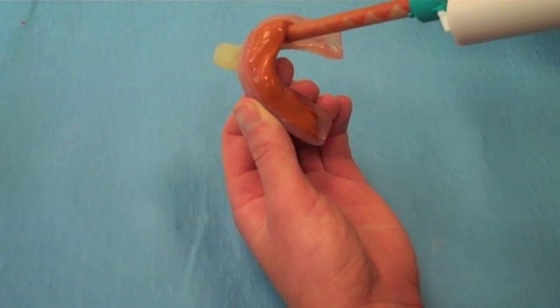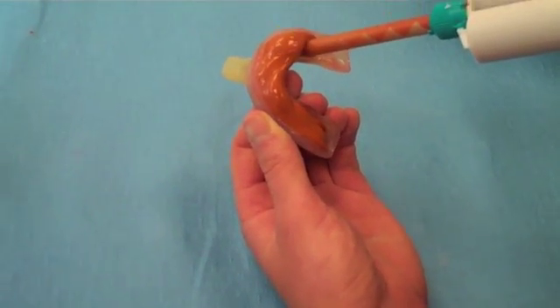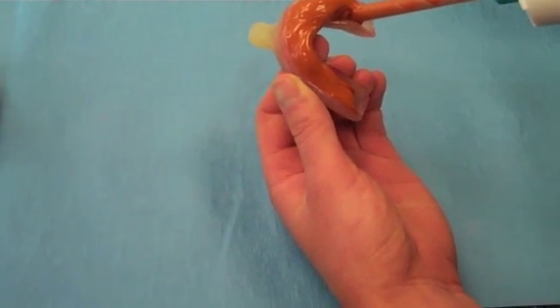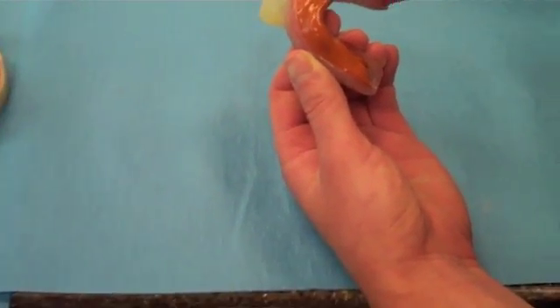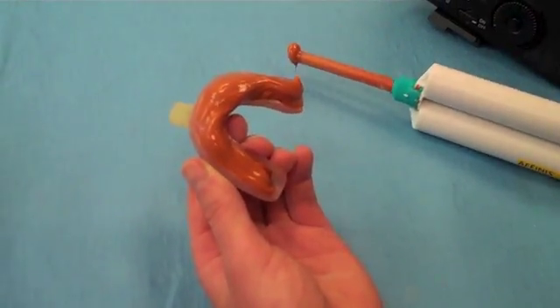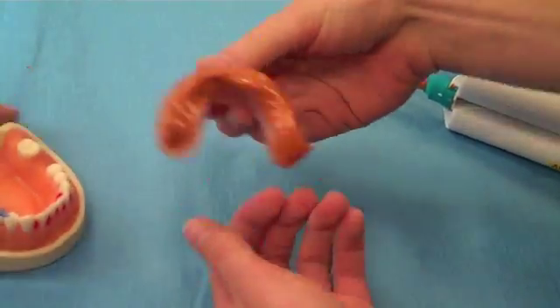Pressure exerted on the tray while polymerizing produces stresses or bends the material and distorts the impression. This distortion will not be evident and result in a crown that fits the die but not the tooth.